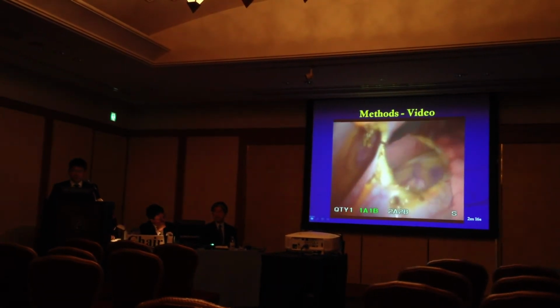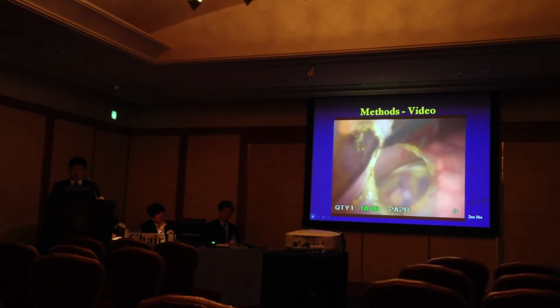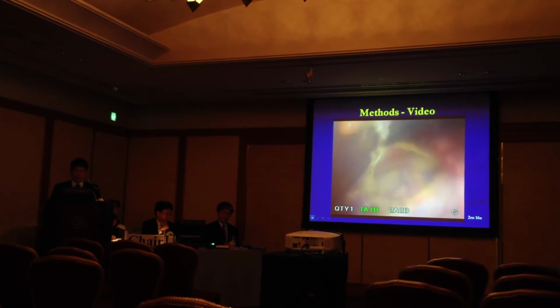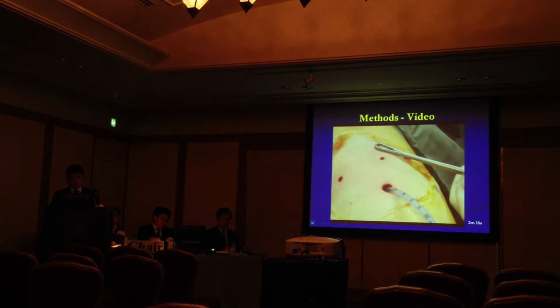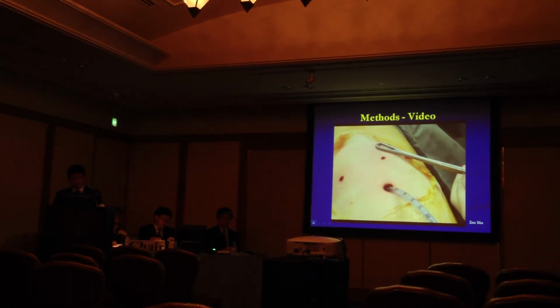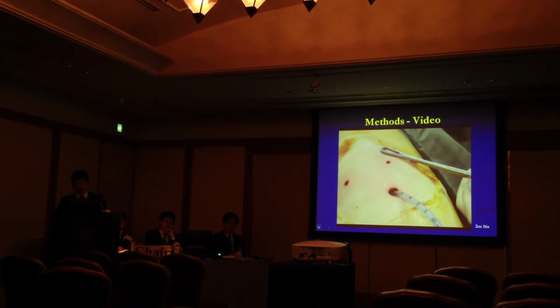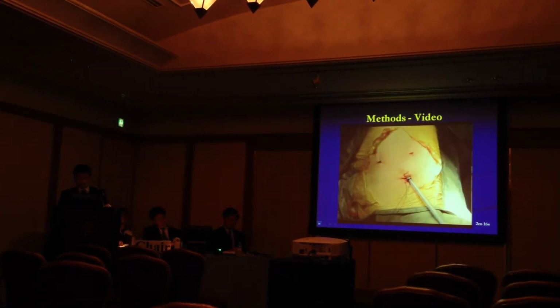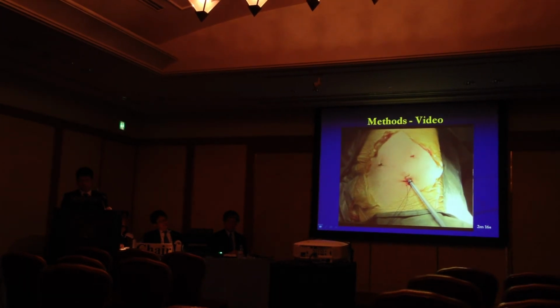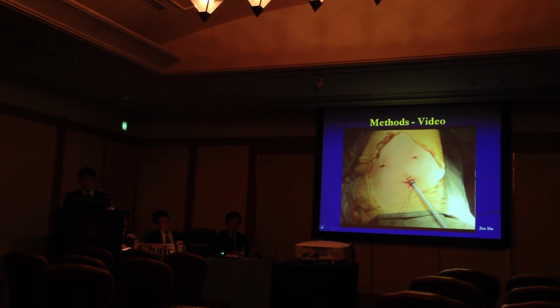So we're basically performing the same operation as in an open, and it can be taught to trainees quite easily. So it's a simple procedure. The pericardium specimen is retrieved through the 10 mm port using 3 mm endo forceps under direct vision, sharing the port with a 5 mm thoracoscope. The procedure is completed with the placement of a 24 French chest drain through the inferior thoracoscopic port towards the apex, secured with silk suture. A single 4-0 nylon suture is applied to each 3 mm incision.